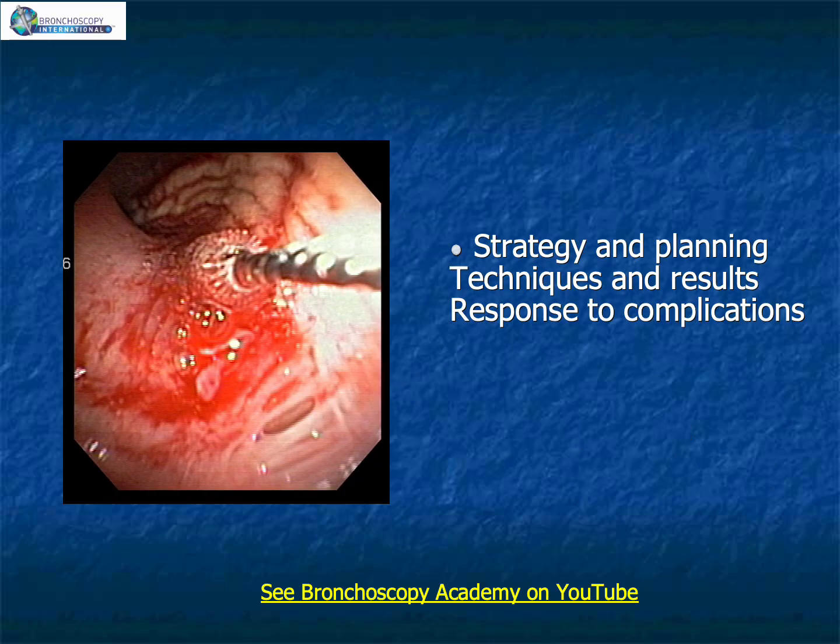This lecture focuses not only on brushing technique itself, but also on strategy, planning, execution, interpretation, and response to complications. Experienced bronchoscopists recognize that outcomes depend as much on preparation as on technical performance. Before introducing any instrument into the airway, one should already have considered: why are we performing this procedure? What abnormalities are being targeted? What information is needed? What complications are possible? Indeed, procedural thinking begins before action.